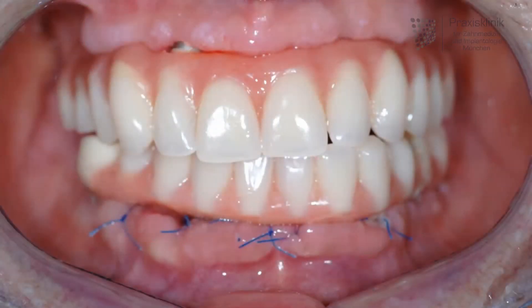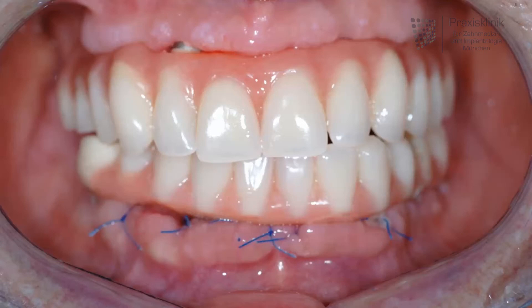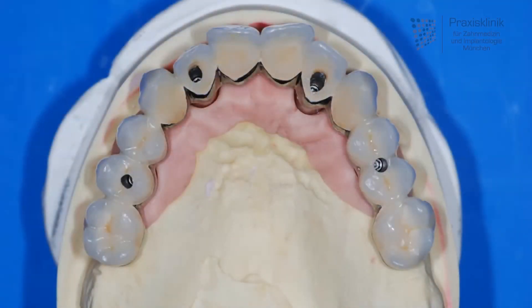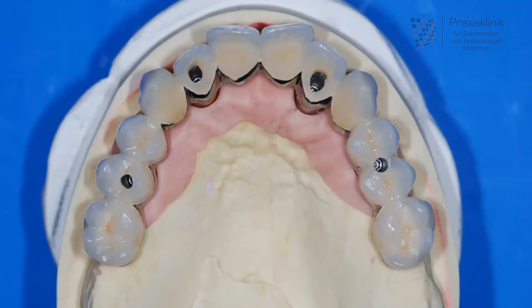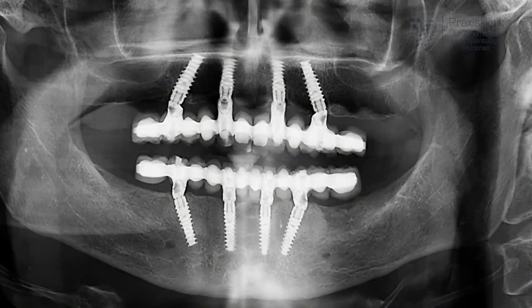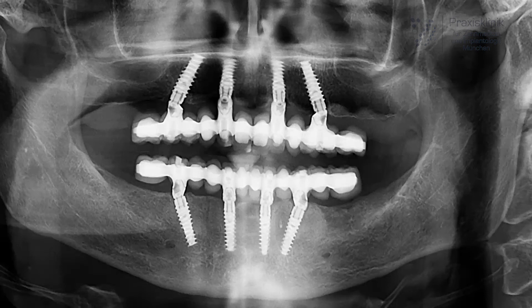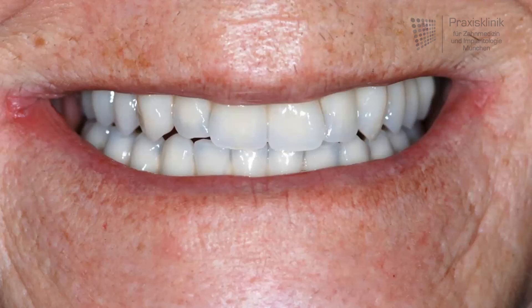This picture shows the temporary prosthesis inserted immediately after the surgical procedure. The patient can use his new teeth immediately after surgery. Three to four months after the surgical procedure, the definitive prosthesis is fabricated in the dental lab. Usually, we take a metal framework which is veneered by composite resin or by porcelain. Which veneering material is used depends on the aesthetic demands of the patient. The final x-ray image shows the situation immediately after insertion of the definitive prosthesis. The intraoral situation looks nice with healthy and sound soft tissue, so the patient gets a smile back. Thank you very much.